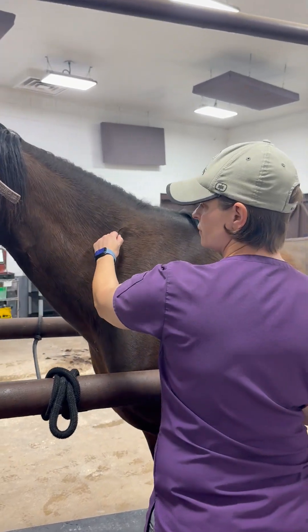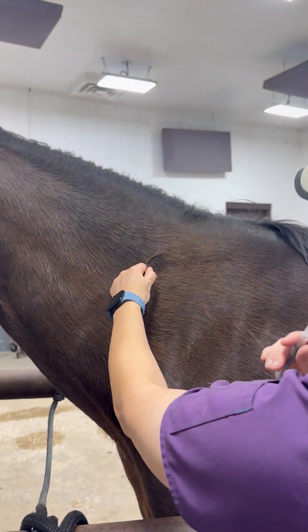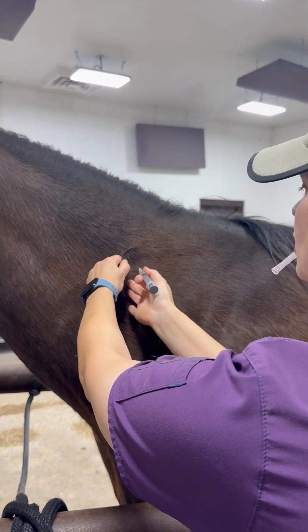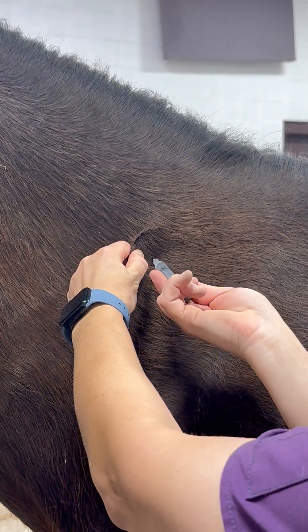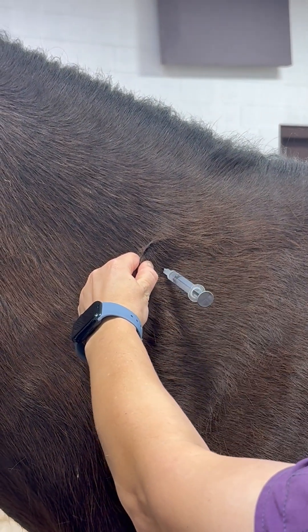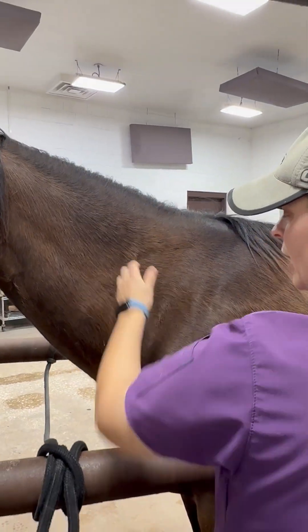I tend to pinch just to feel like I have a hold of the horse. Make sure you have a handle on the horse's head. Take your injection, insert the needle gently all the way in. Then you want to draw back to make sure there's no blood, give whatever you're giving into the muscle, and then pull all the way out.